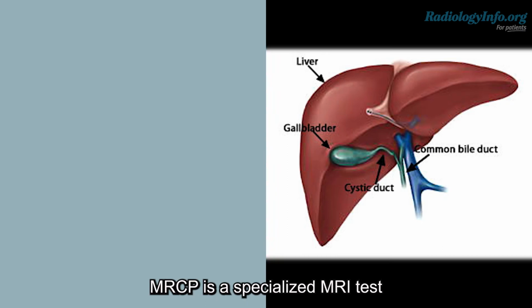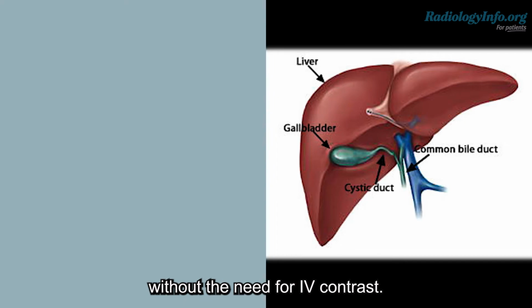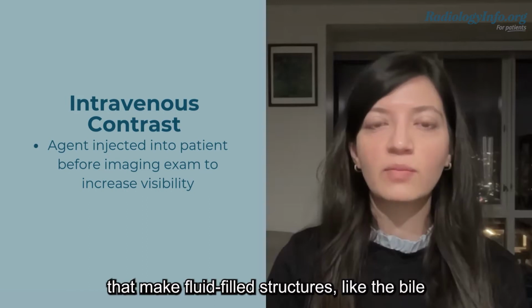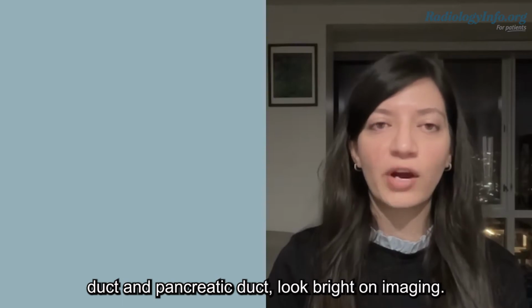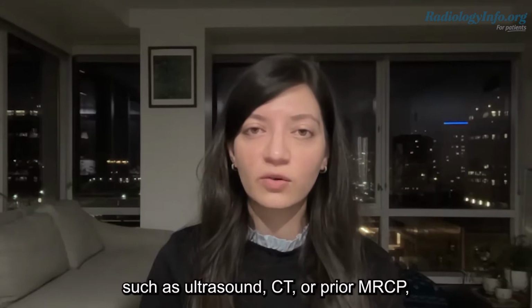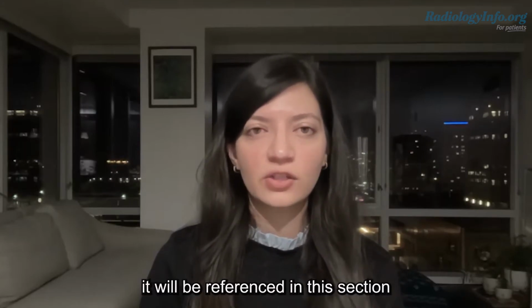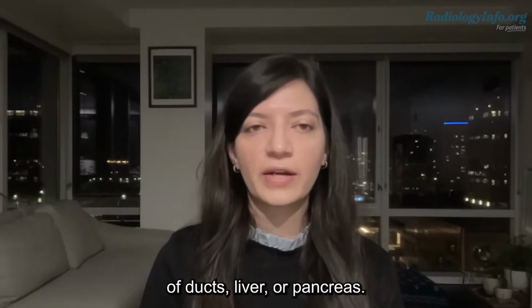MRCP is a specialized MRI test that focuses on biliary and pancreatic ducts without the need for IV contrast. Instead, it uses special techniques that make fluid-filled structures like the bile duct and pancreatic duct look bright on imaging. It is a non-invasive and radiation-free test. Comparison. If there is a previous imaging test such as ultrasound, CT, or prior MRCP, it will be referenced in this section to see if there is any change in the appearance of ducts, liver, or pancreas.